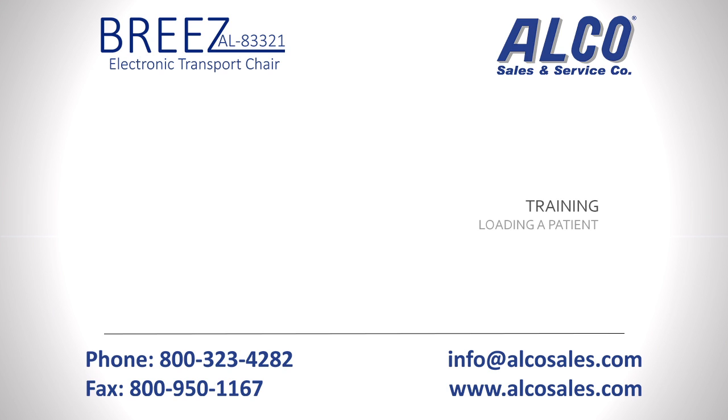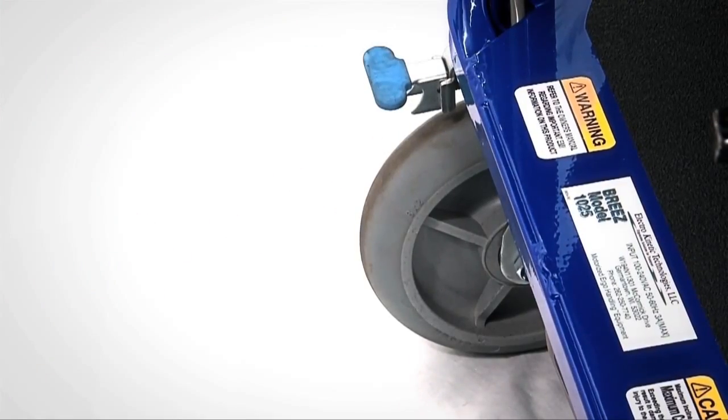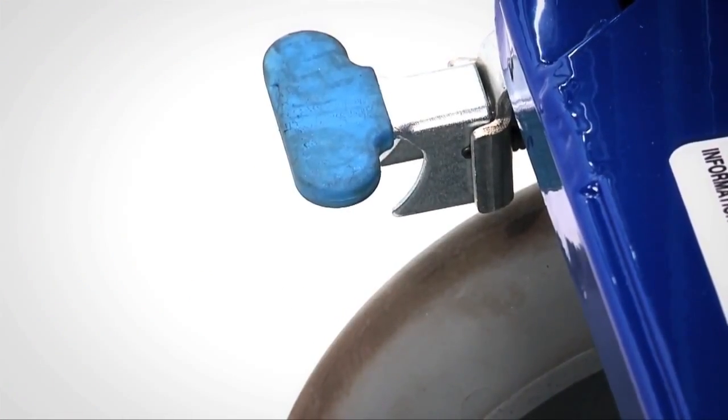When loading a patient, be sure that the Breeze is on a clean and level surface. First, lock the rear casters to prevent the unit from moving. To do so, align the rear casters so they are facing forward, then move the locks up. This will prevent the chair from moving.